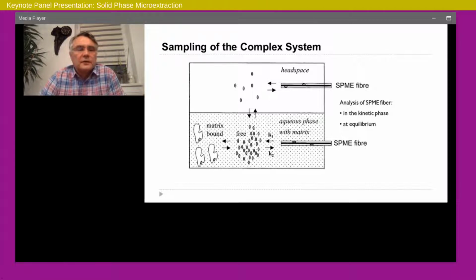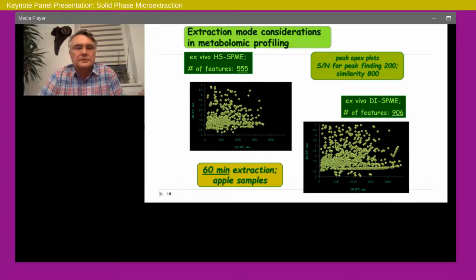So in fact, anything which goes via free form to the coating, as long as the matrix components shown here, like proteins or pieces of tissue, do not adsorb on the fiber, you have a very clean extraction as well, because it goes via free form. This means it is reasonably soluble in water, so we can dissolve it in the solvent of the LC injector and then introduce it to the LC and basically perform the separations on the clean matrix.